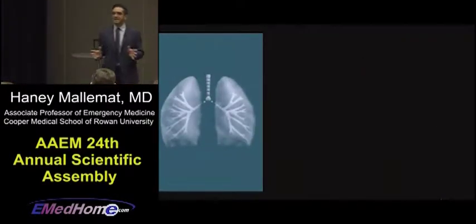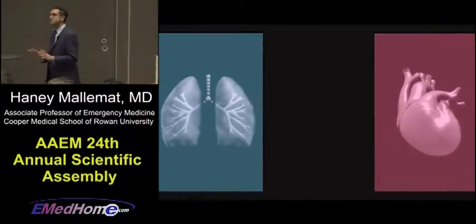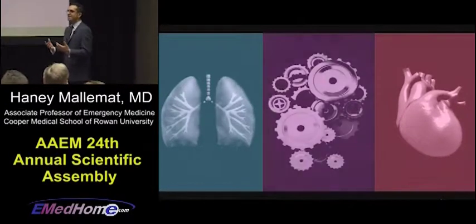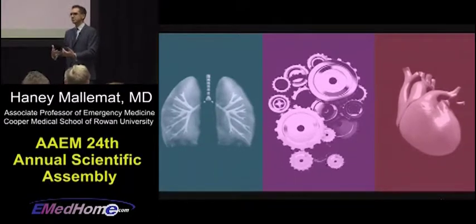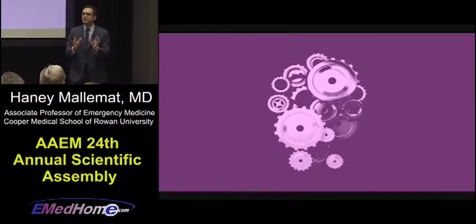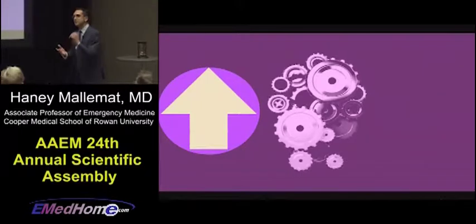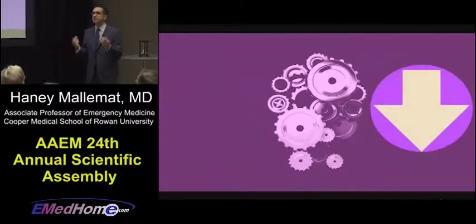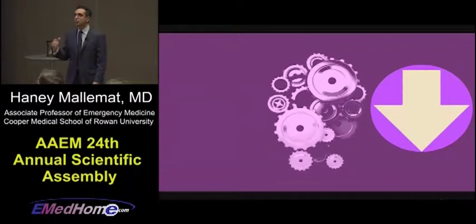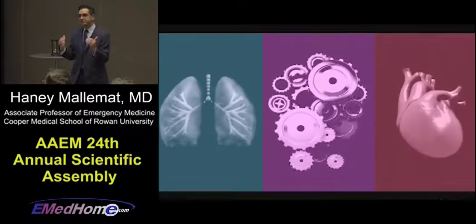Now you need 3 things to get end-tidal. You need lungs to blow CO2 out. You need cardiac output to push the CO2 in the blood to the lungs to get them breathing out. And then you need cellular metabolism to make CO2 to get to the heart, to get pushed out, to get out the lungs. But you can look at each one of these things independently. So you can interpret increases in metabolism. Someone who's hyperthermic, someone who's shivering, someone you give a big bicarb bolus to, their end-tidal CO2 is going to go up. And you can also look at decreases in metabolism, things like DKA, or a response to a fever when you give them acetaminophen, by looking at the end-tidal CO2.